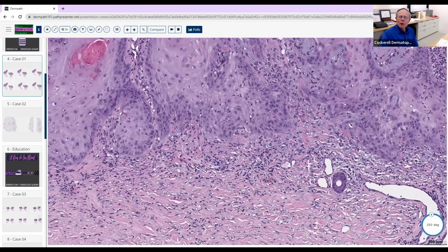Yeah, and when you're dealing with those kinds of things, you'll see a suppurative granulomatous inflammation in the dermis, and then you get the secondary pseudoepitheliomatous hyperplasia overlying it. What's actually happening in those situations, in many cases, is that the host is trying to transepidermally eliminate the process, right through the epidermis. That's why you get those abscesses that form, and you see the little channels that get formed in the epidermis.